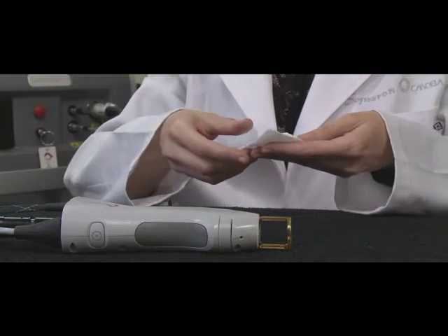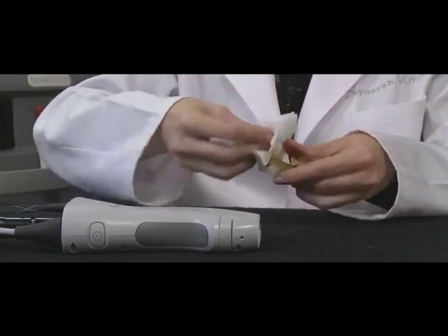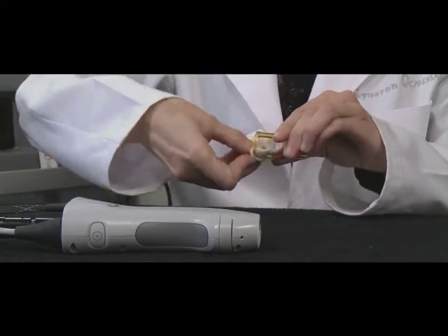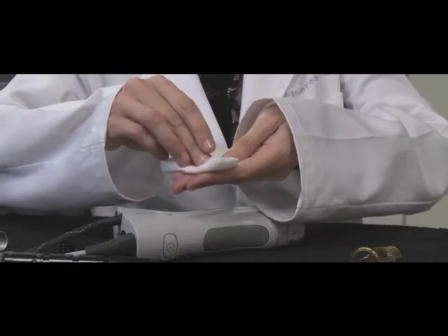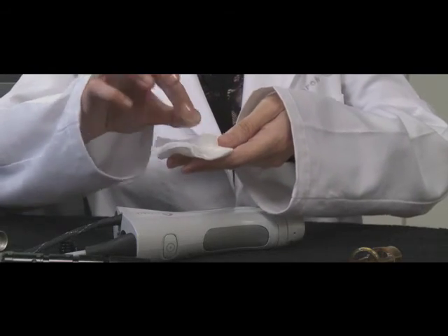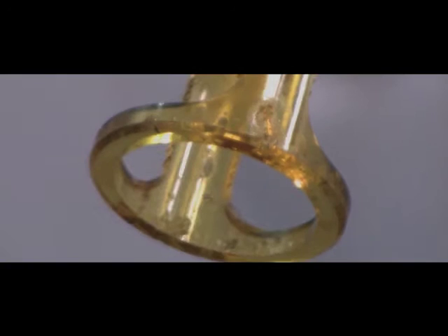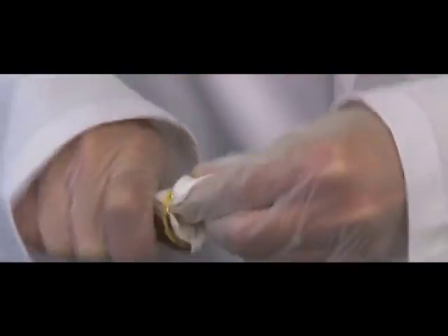The following are maintenance tips that are especially important after hair removal treatments. Be sure to clean the distance gauges, inner slider, and window. The distance gauge should be cleaned with alcohol between every patient. Any darker spots can be cleaned with the diluted bleach solution at the end of the day.